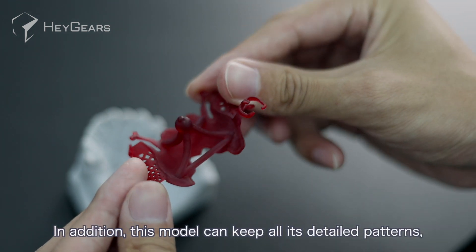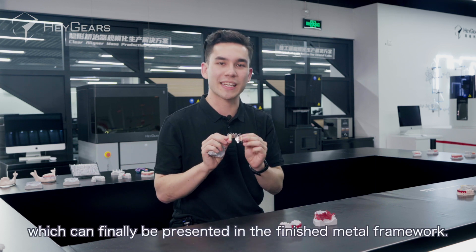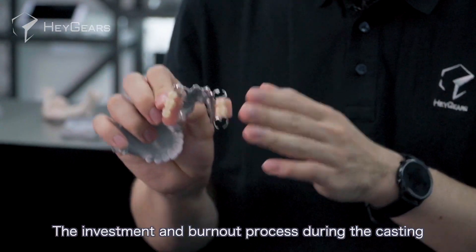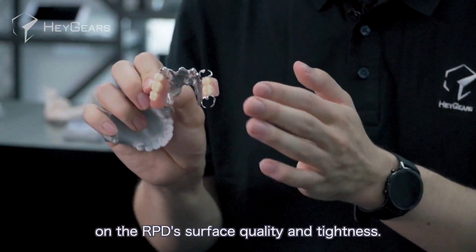In addition, this model can keep all its detailed patterns, which can finally be presented in the finished metal framework. The investment and burnout process during casting has a crucial influence on the RPD's surface quality and tightness.